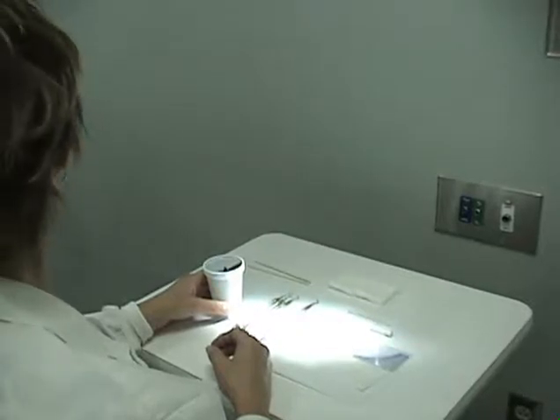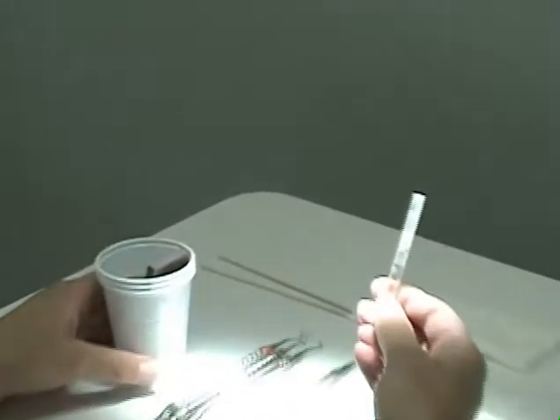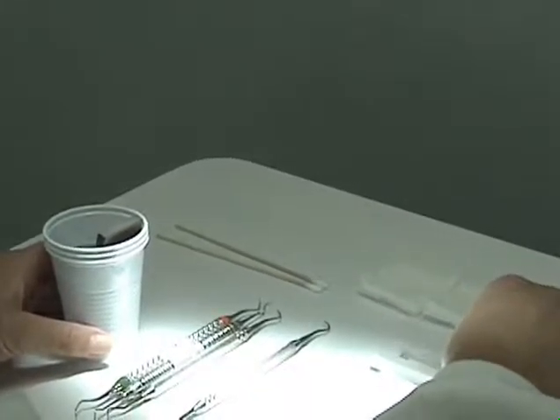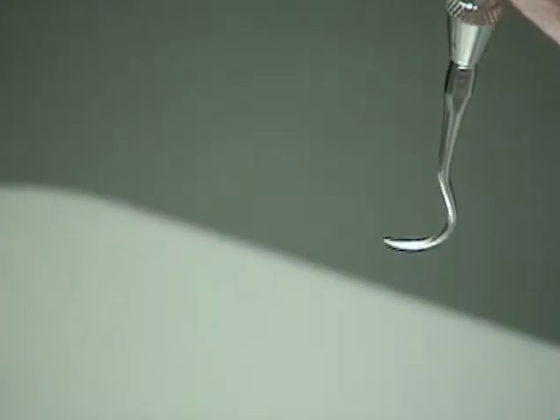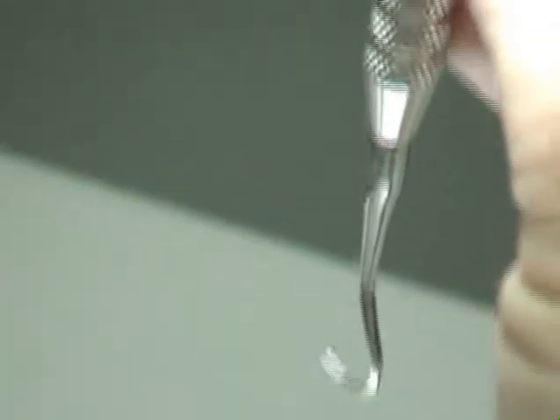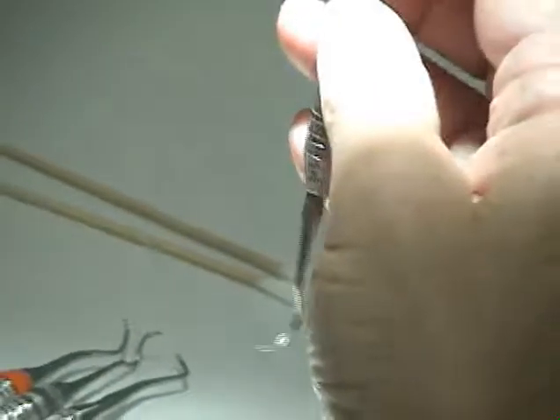Sharpening is determined by using a test stick or a light test. If a blade reflects light on the cutting edge, the instrument is dull. You'll need to replace your instruments when its original shape has been significantly altered.